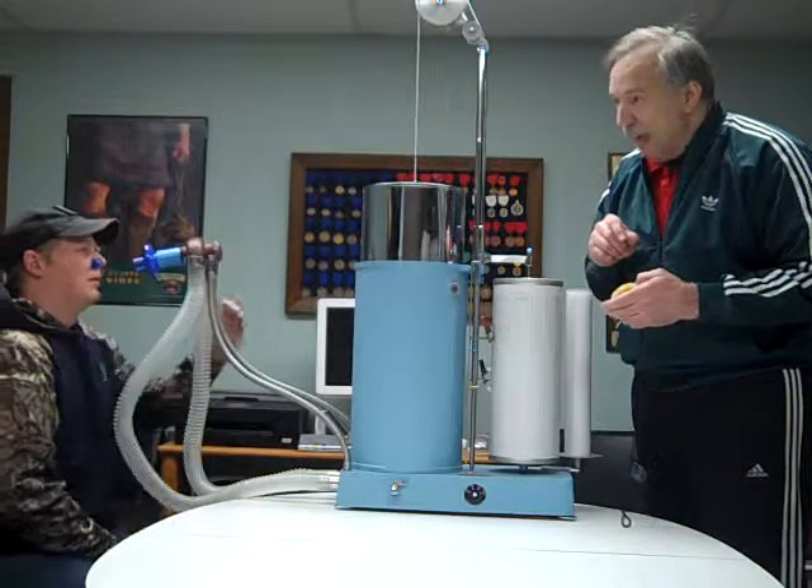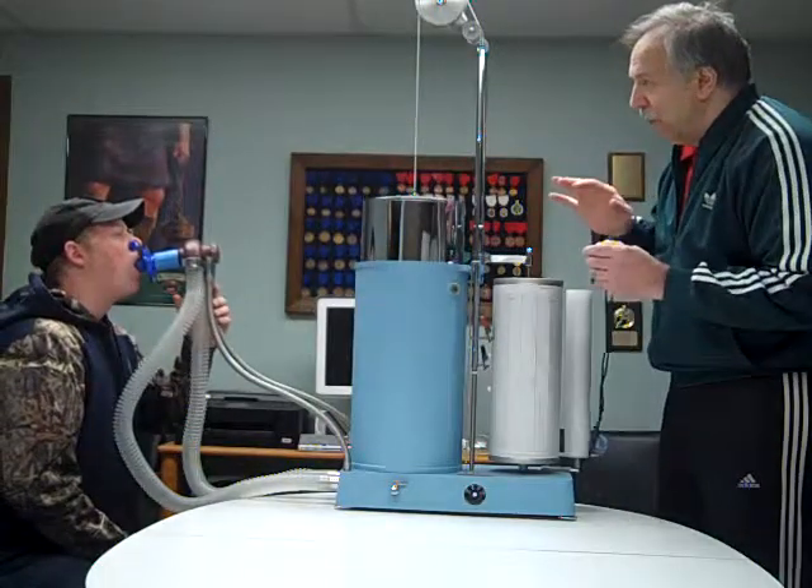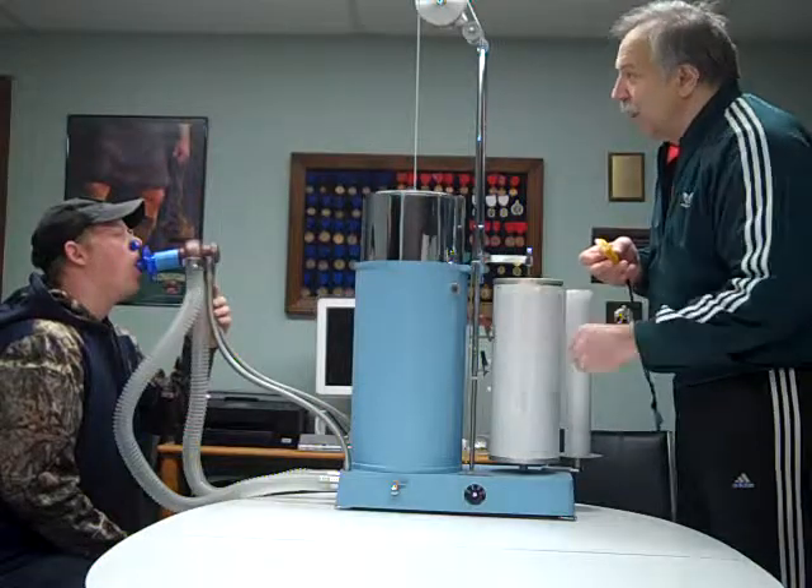I will say: on your mark, get set, go. So why don't you take a couple of nice, normal breaths — get yourself comfortable and ready. And when you think you're all set and ready to go, just give me the signal and I'll give you the countdown.